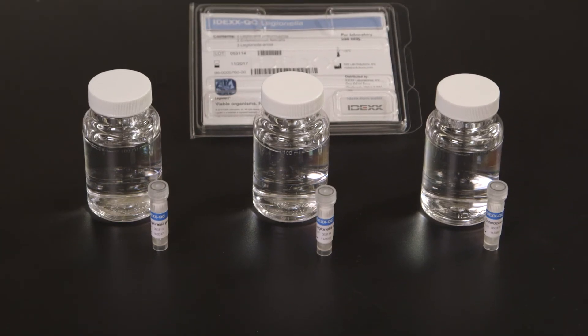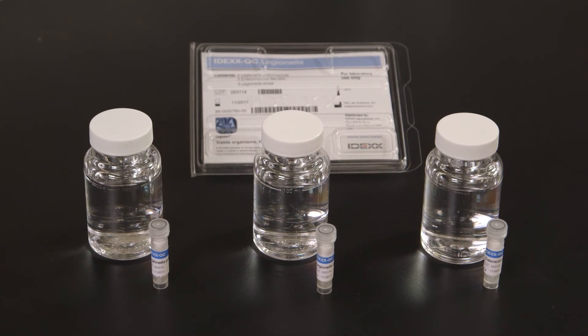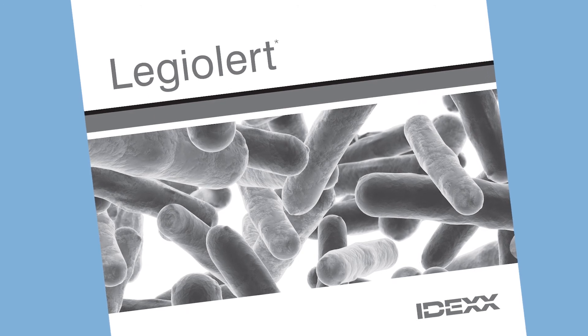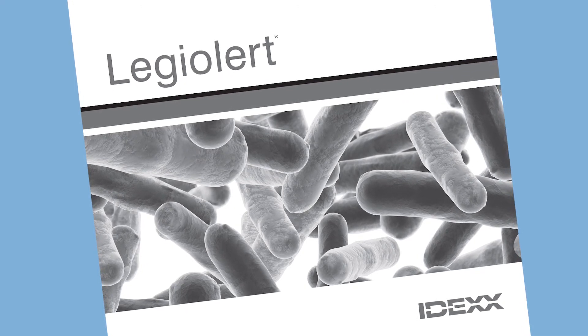IDEXX recommends that you run a quality control procedure for each lot of Legiolert tests. You will find the quality control procedure in the Legiolert product insert.